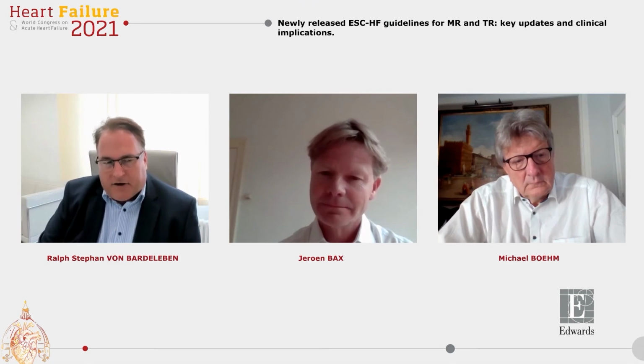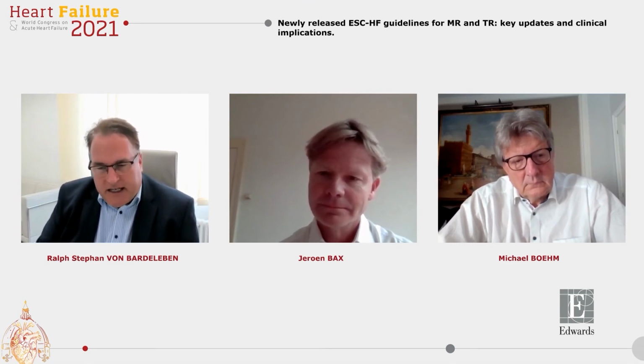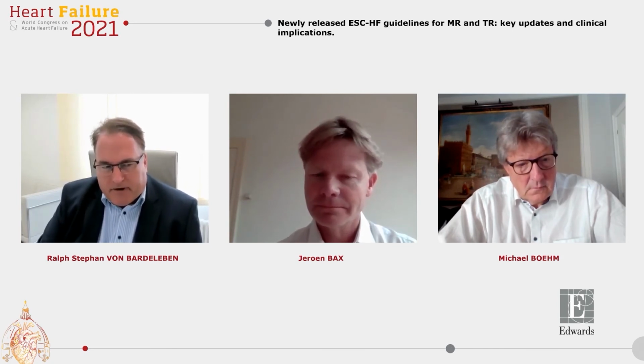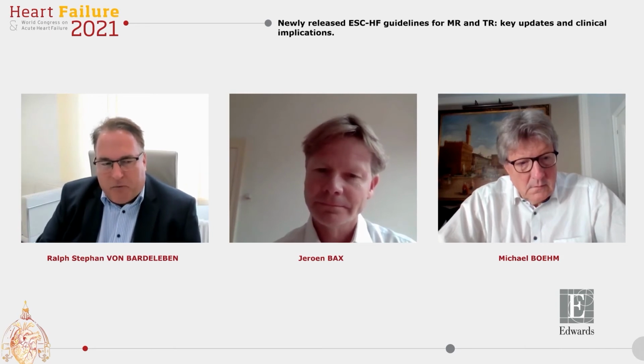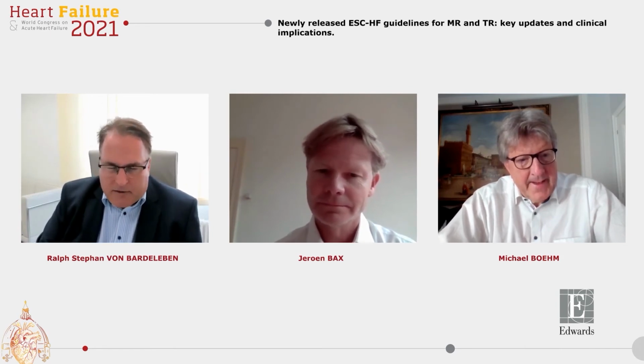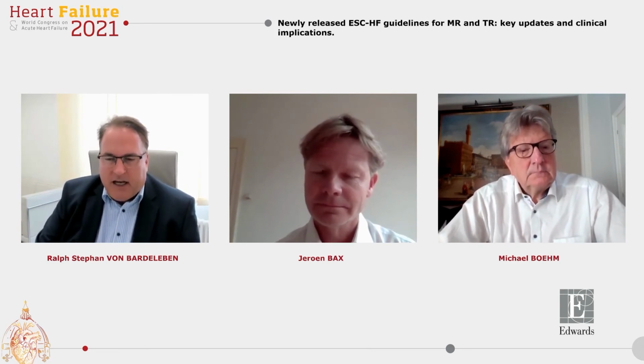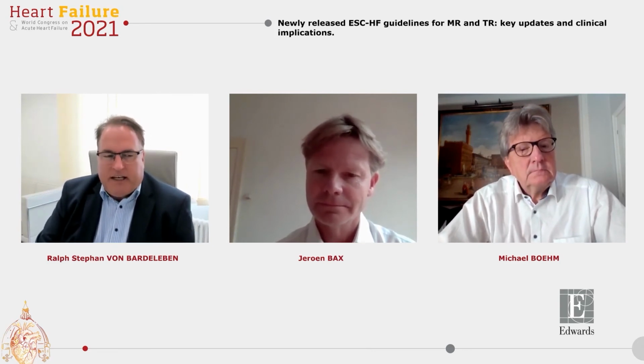In transcatheter cardiology, we're able to actually wait for GDMT effects for 1 or 3 months. And I would also wait for 1 or up to 3 months for the effect of the mitral repair, which improves tricuspid regurgitation, especially in the group of moderate to severe. It will not improve actually torrential or massive regurgitation. There you have to additionally treat the tricuspid.